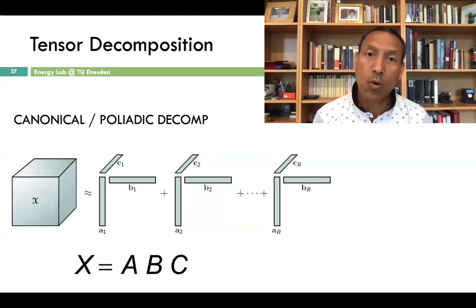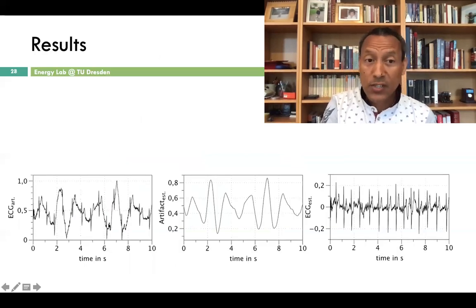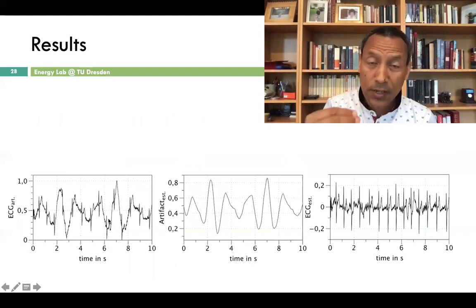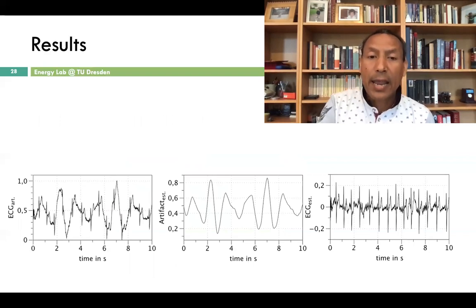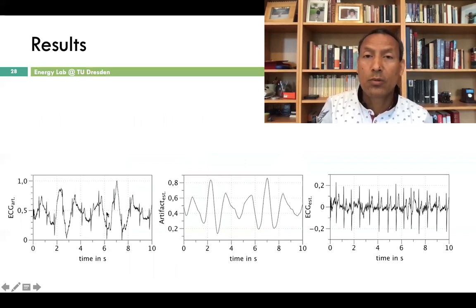And this helps us to know the motion artifacts more cleanly and more clearly. So what happens is here we have now the corrupted ECG signal. We intentionally corrupt the ECG signal. And this is the motion sensor we used to corrupt this signal.